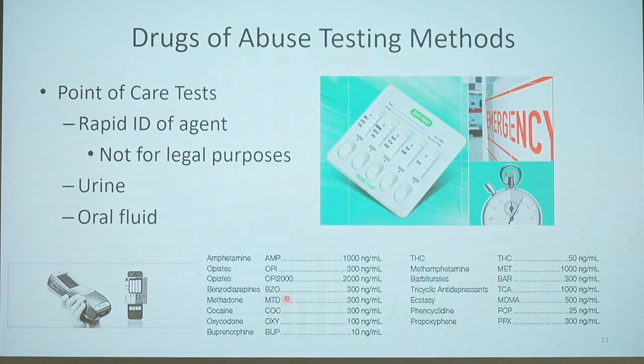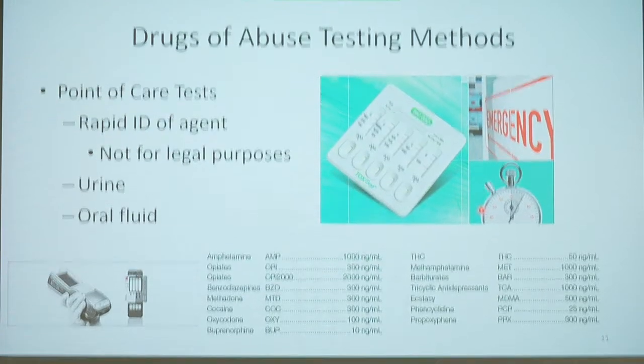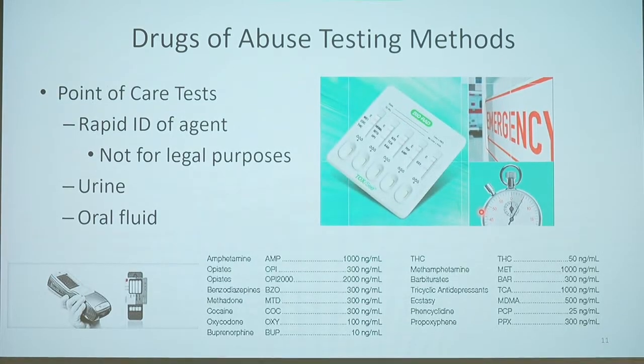Does anyone know why there are 2 opioid levels on the standard urinary drug screen? Is it for heroin? Not for heroin. Is it because it metabolizes into another opioid? No, but it does, so you're correct.